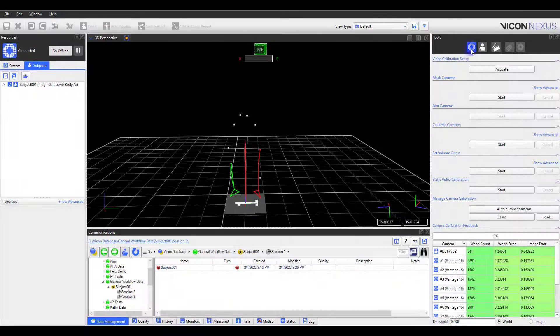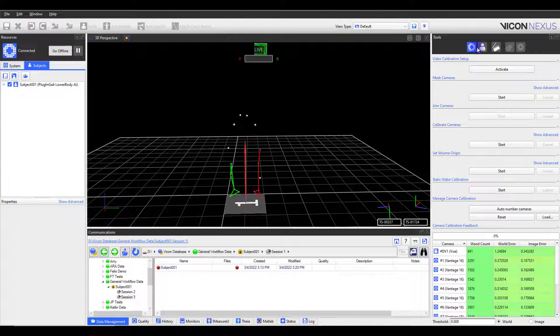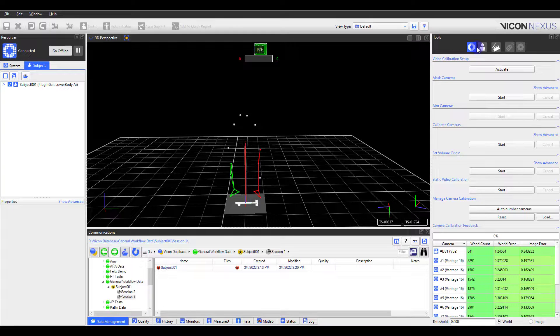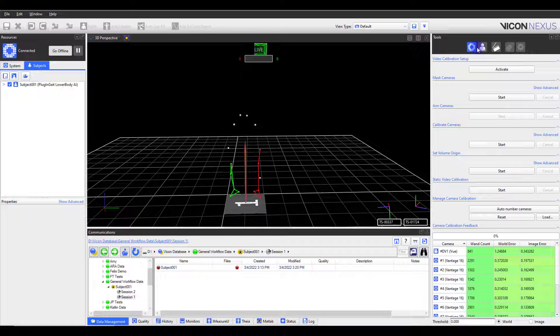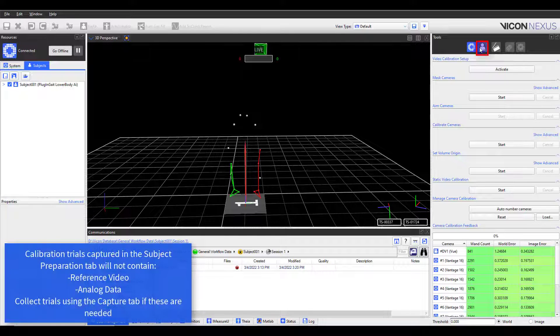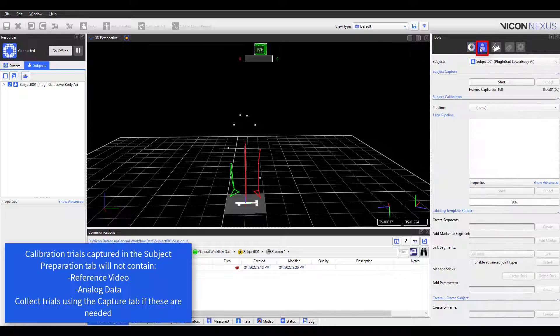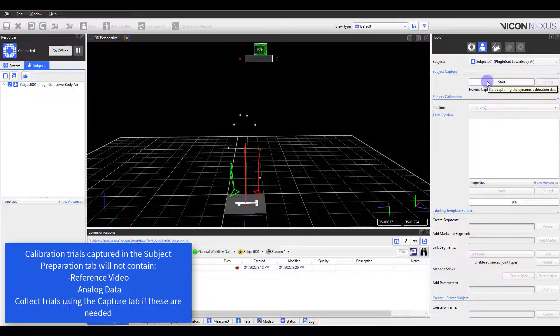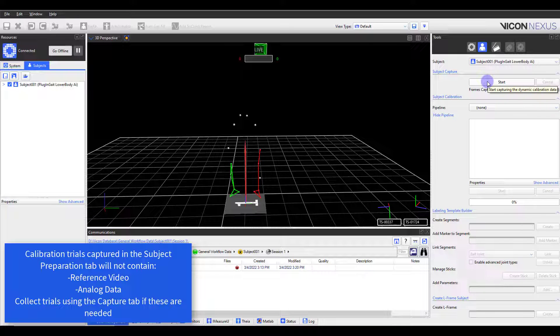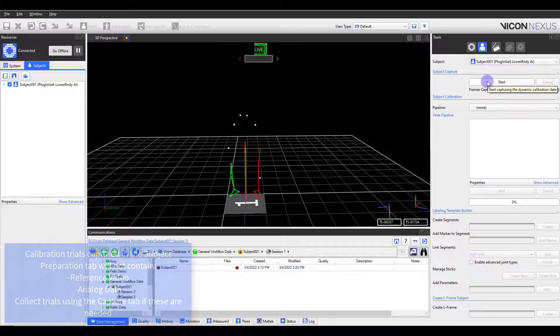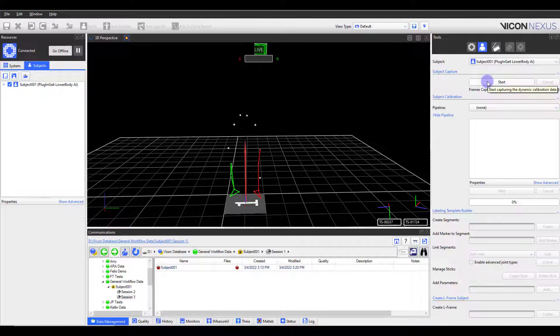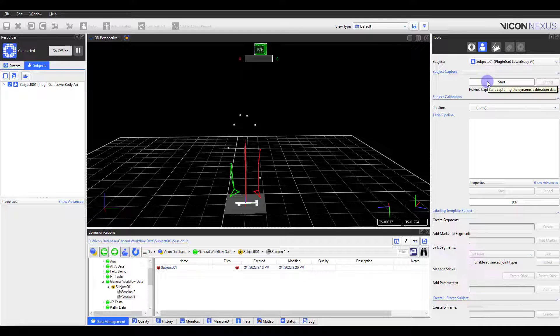Now that I have set up my subject, I am ready to collect the static trial which will be used to calibrate my labeling template. I'll navigate over to the Subject Preparation tab and have the subject stand in the center of the volume in the static pose. Correct labeling does not matter at this point, as the labeling template has not been calibrated to this specific subject. But I do want to confirm all the markers are visible for at least one frame. The labeling will improve after we process the static trial.